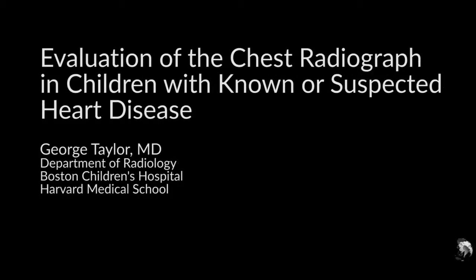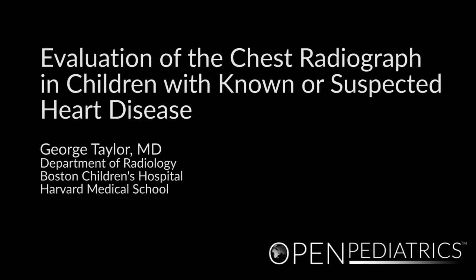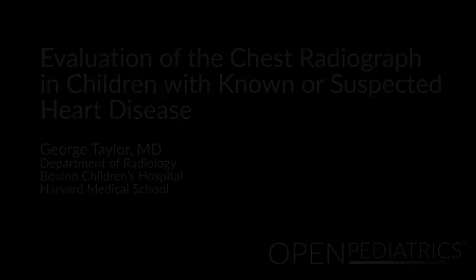Evaluation of the chest radiograph in children with known or suspected heart disease by Dr. George Taylor. My name is George Taylor from the Department of Radiology at Boston Children's Hospital, and in this session we're going to be talking about how to evaluate the chest radiograph in children with known or suspected heart disease.